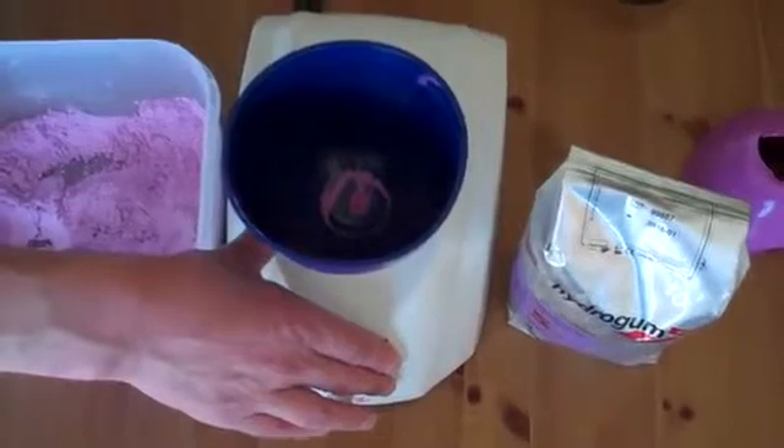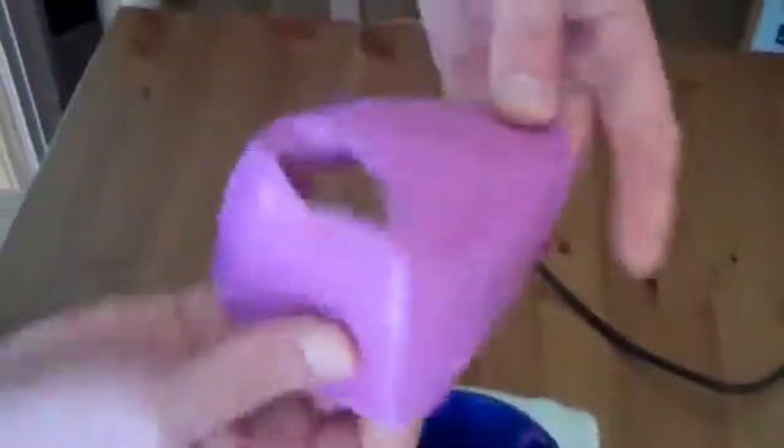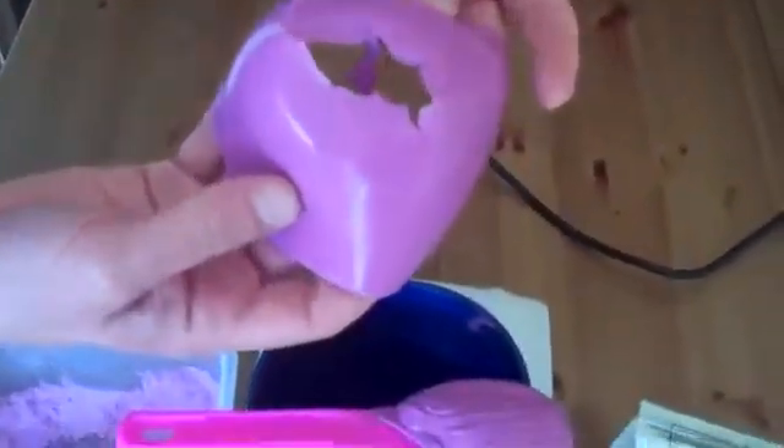That is an absolutely fantastic bubble-free mix. And just to prove it is bubble-free, here's my blue peter from earlier. And you really can see, right the way around, that there are no bubbles.